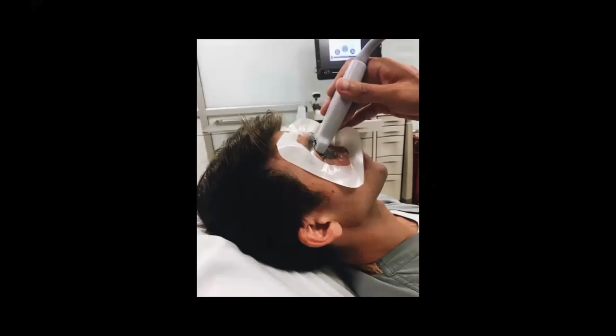You're not going to get a ton of attenuation through the eyelid, and so you'll get the images just fine. Now, the big question that comes up is, do you use a Tegaderm or not? This is definitely a point of debate out in the literature, and even here in the department. Do you need a Tegaderm? Do you not need a Tegaderm?